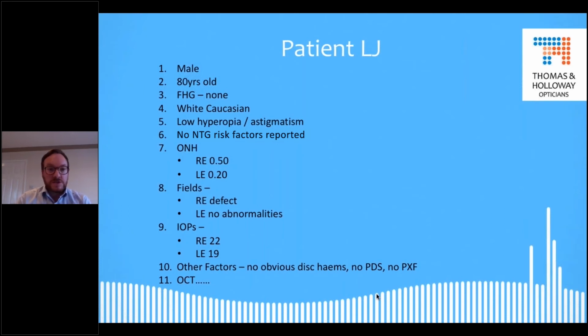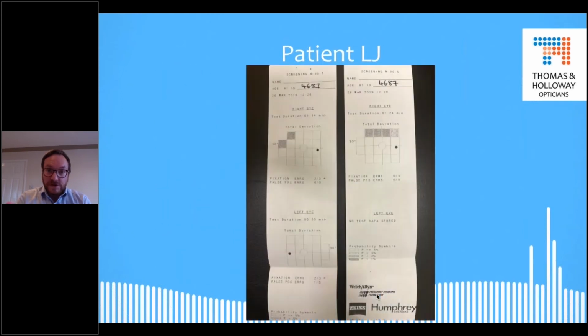So let's have a look through the OCT on this one. These are the visual fields, by the way. I just started off with FDT fields. So we do have a slight something going on in this superior area, but it's not drastic. And in fact, between the two, there's only one repeatable point missed. And you know, often if it weren't for some of the other factors, you may just bring this patient back maybe in 6 months, or refer into a glaucoma referral refinement pathway if you have one available in your practice.